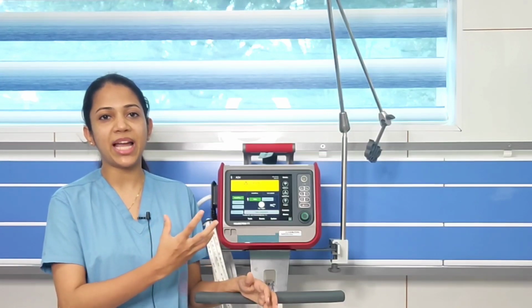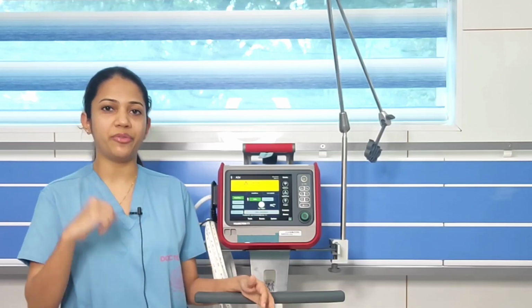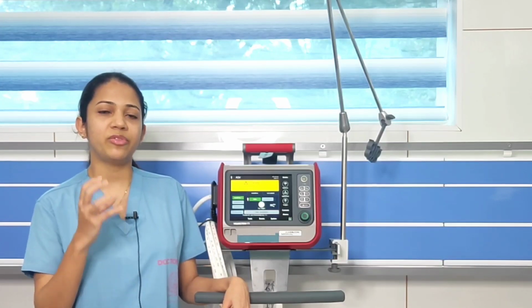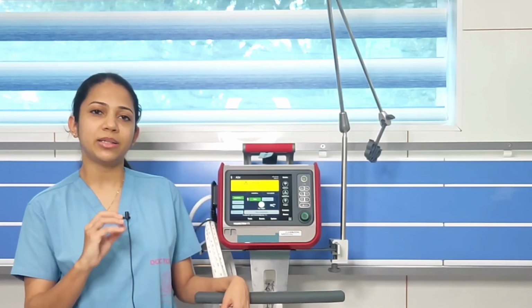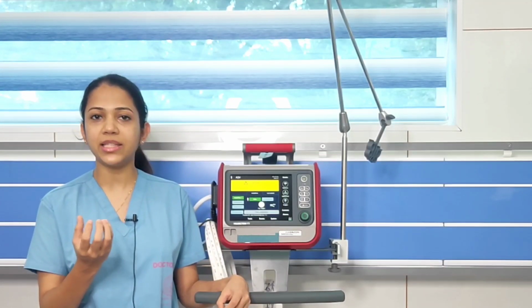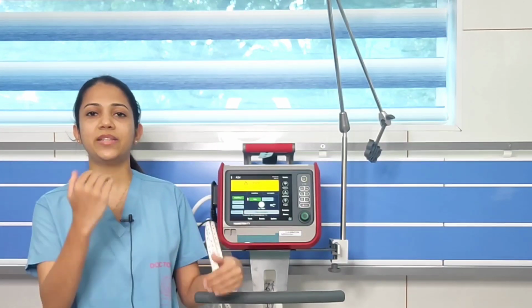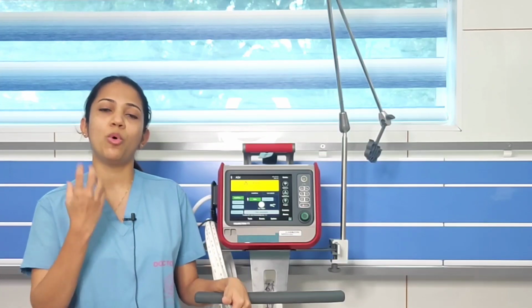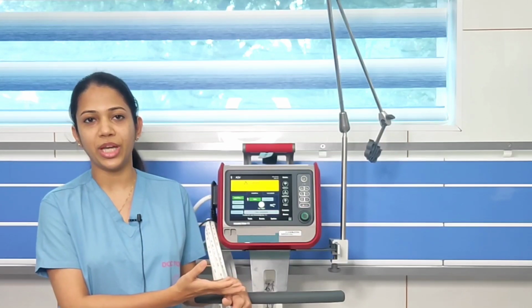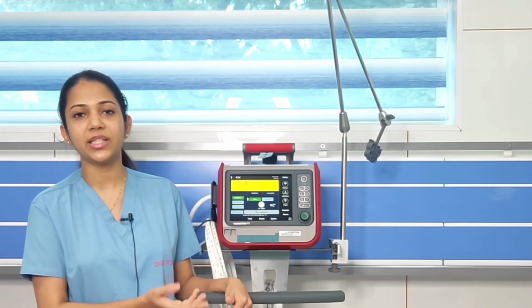And if we are keeping it as -5 centimeters of water, the patient should make that much effort, so that much negative pressure will be generated, and that will be sensed by the ventilator, and the ventilator will provide the breath. So as we set the pressure more negative, the ventilator sensitivity will reduce and the patient will have to put in more effort so that the ventilator will sense the trigger of the patient.